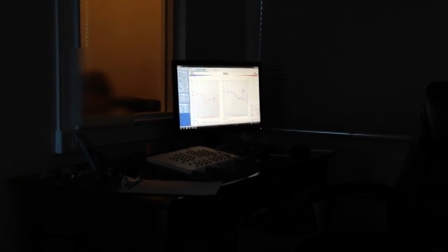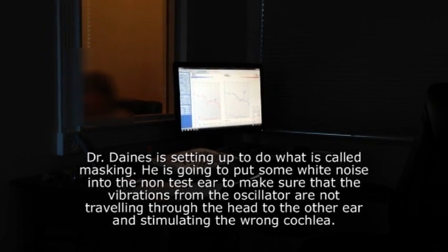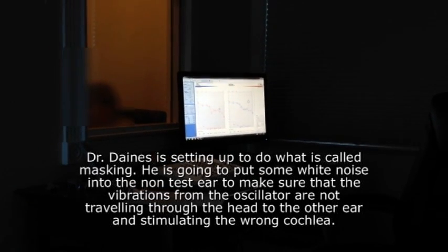To concentrate on that one. Yes, you do. Okay, I'm going to put this back in on this side. I'll put a little bit of noise into this right ear. It will sound like static. I just want you to ignore that and listen for the beat. Push the button when you hear the beat.